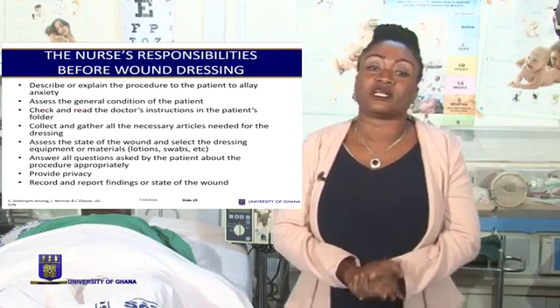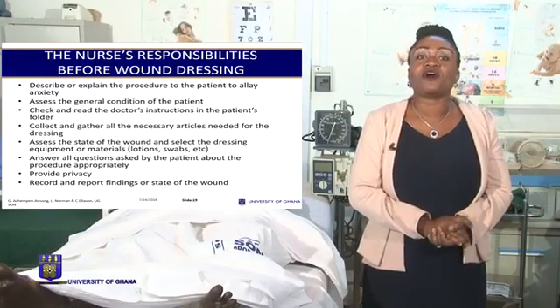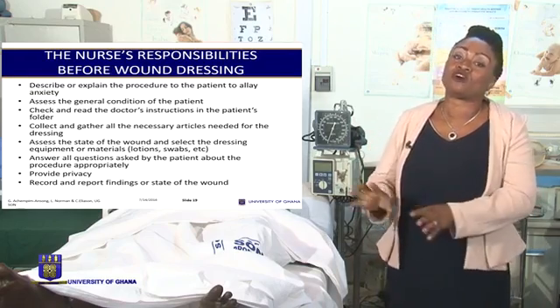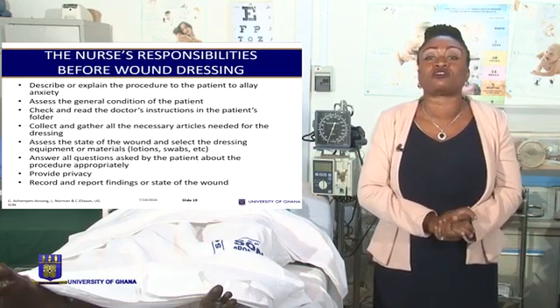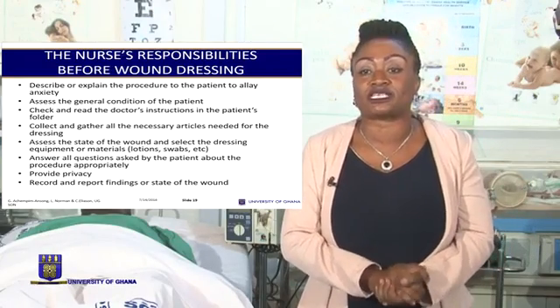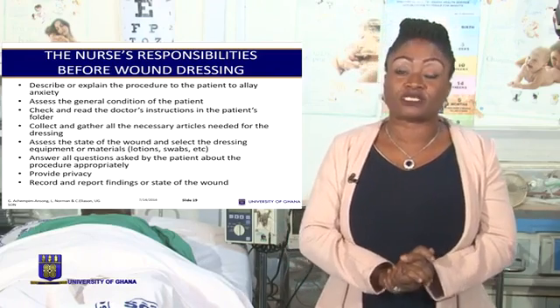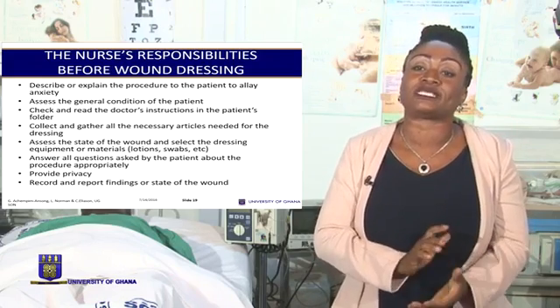Now we come to the bottom shelf of our trolley, which is considered clean but not sterile. On our bottom shelf, we have our dressing pack, and this dressing pack will later on be used in setting up the sterile top shelf. Then we also have our cotton wool and gauze swabs. We have a receptacle for the used or soiled dressings or cotton wool swabs. We also have a receptacle in which we are going to put our used or soiled forceps, a dressing Macintosh and towel to protect our bed.